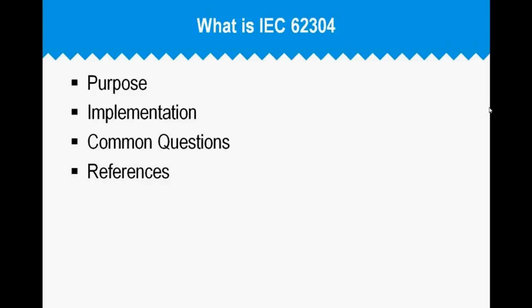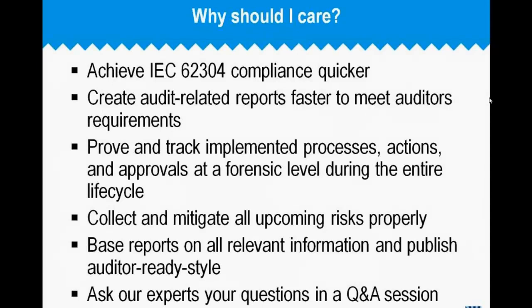It's also helpful to onboard people or educate management about what is the software development lifecycle that you're choosing to use. As a device manufacturer, why should I care about 62304? Primarily because if you can't point to some reasonable standard of your software development lifecycle, you're going to have difficulty getting European approval of your particular device. So there's a requirement to define what your software development lifecycle is. If you're not going to use 62304, you have to point to some other standard or provide sufficient documentation that the agency feels that you're under sufficient control and that you're equivalent to the standard.